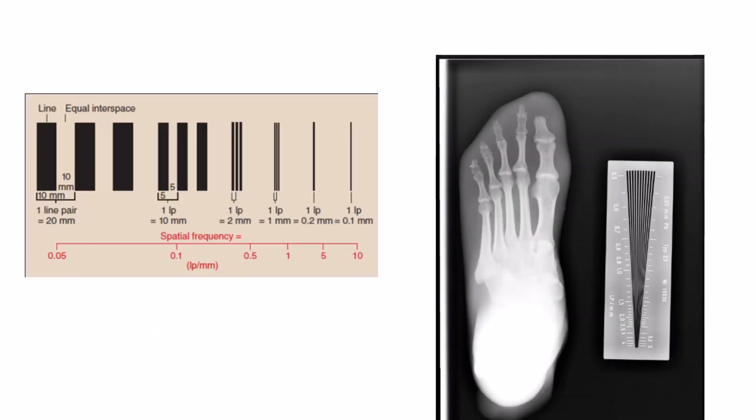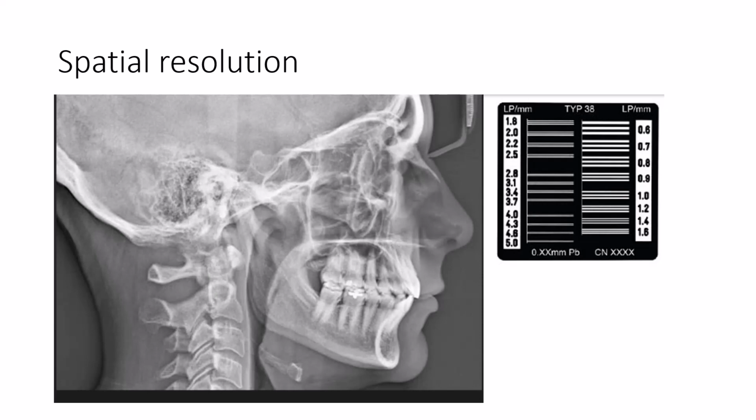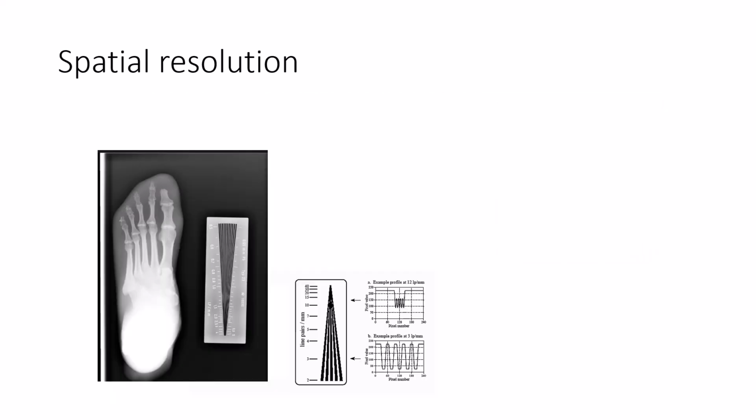Spatial resolution is the ability of an imaging system to resolve and render detail on the image. The final image has good detail and contrast and brightness so that you can differentiate between the different anatomical areas fairly easily, even when they are close to one another. That is, close in proximity and close in shades of gray.